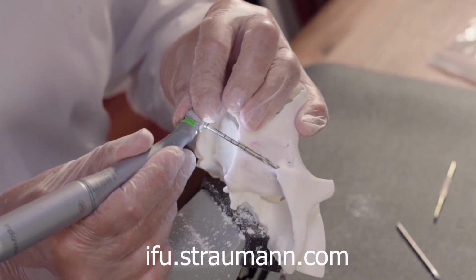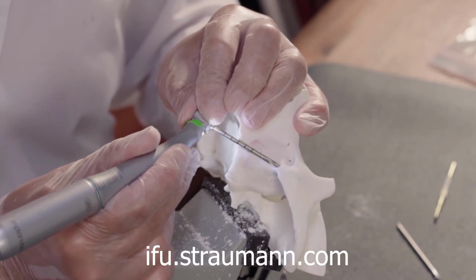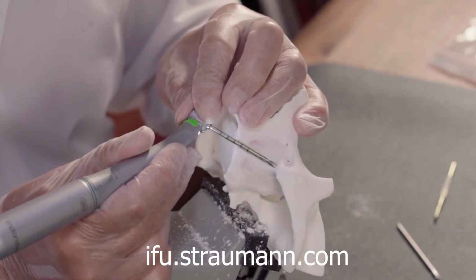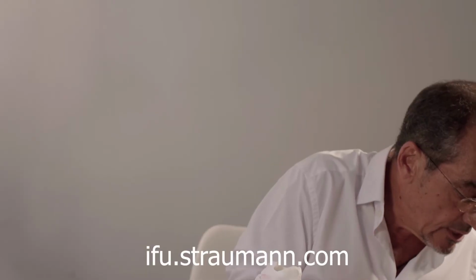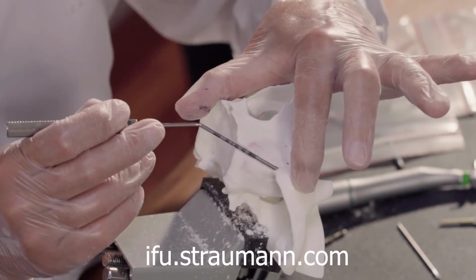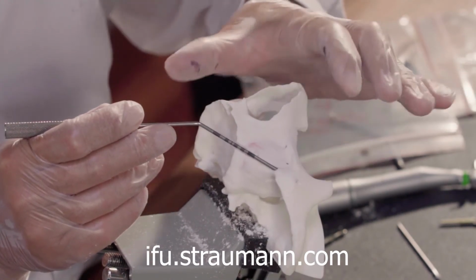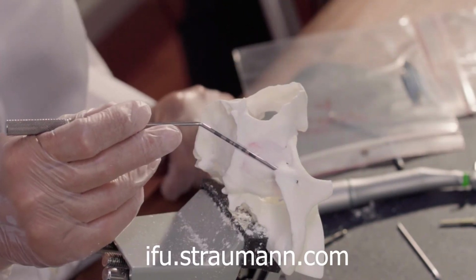And again, I will finish now the perforation. Four, water, 1, 2, 3, 4, water. Implant transporter, and a flat design for this osteotomy. Let's measure first how long this osteotomy is, and again you may use your finger pressing the skin in order to note where the gauge is, or you may use the gauge hook to try to figure out how long this implant is going to measure.